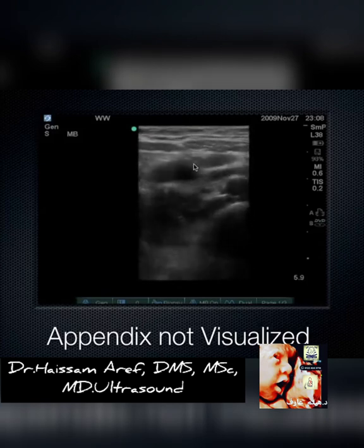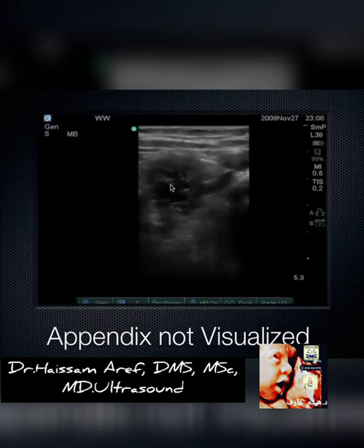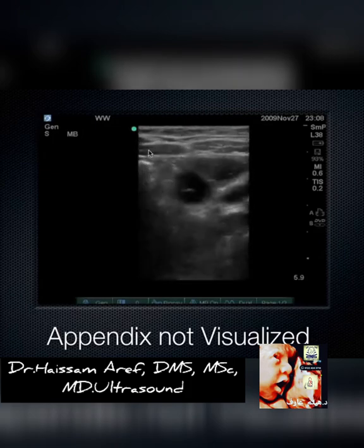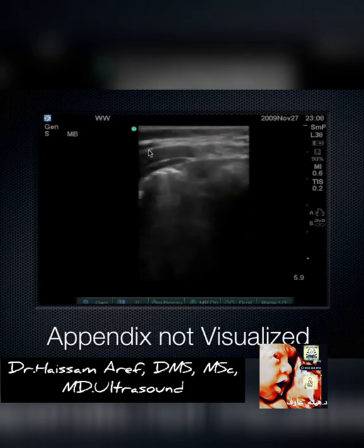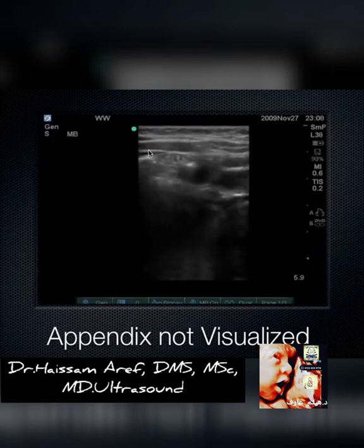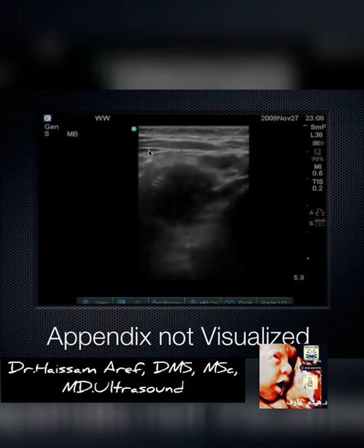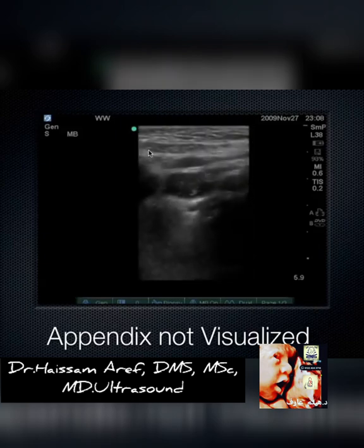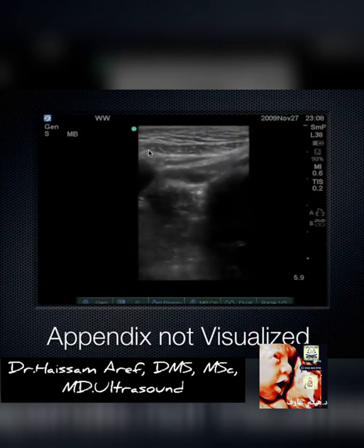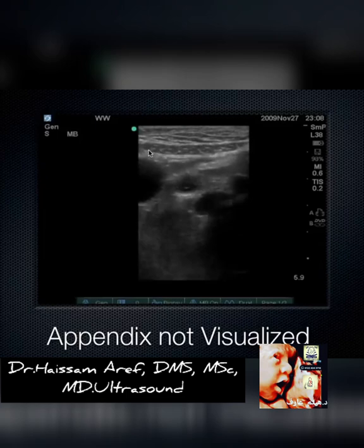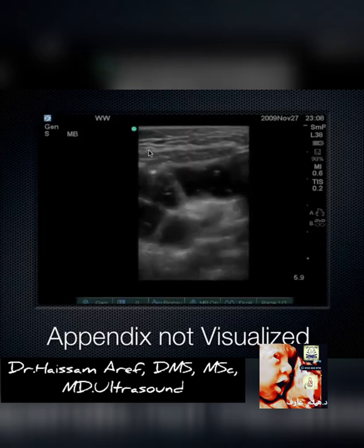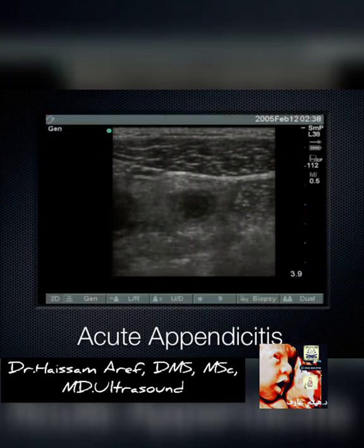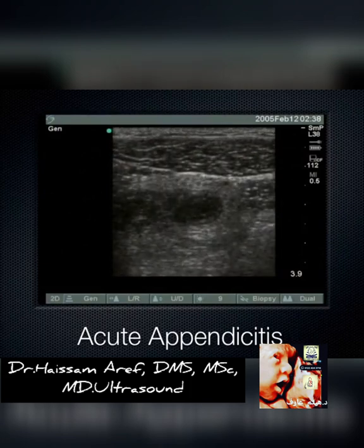When compressing we see all these loops of bowel, some filled with fluid, and here's the psoas coming all the way up to the abdominal wall musculature. In this part of the body the abdominal wall musculature is the abdominal obliques. Coming a little more medially you can see the rectus abdominus, and crossing midline you see the rectus sheath and the other rectus on the other side. You can look at all that as you're mowing the lawn of your patients.